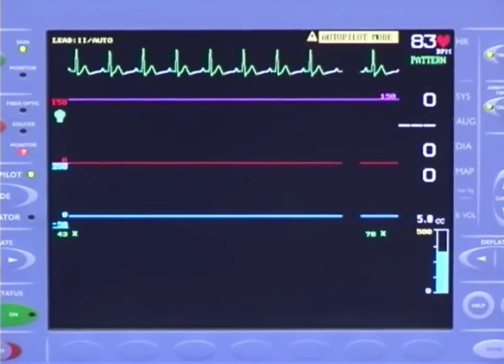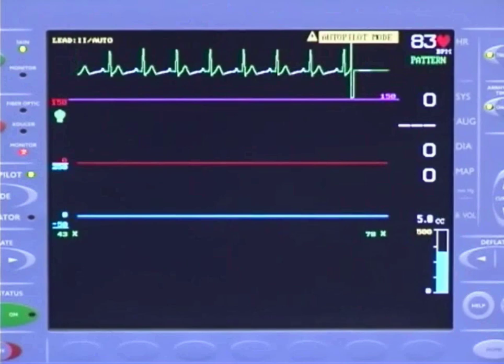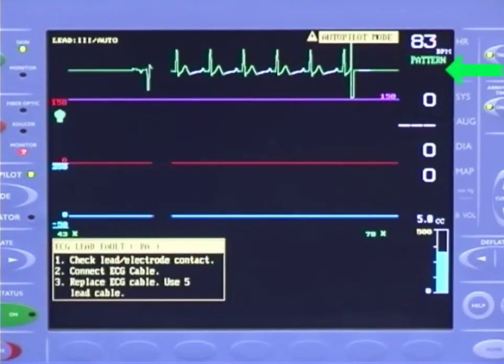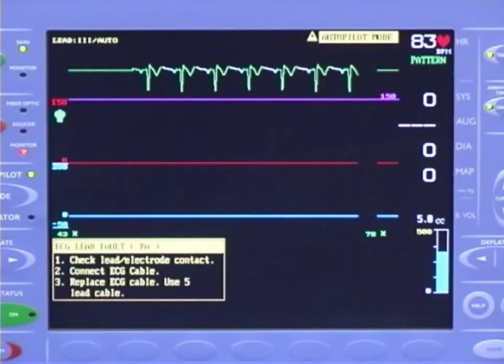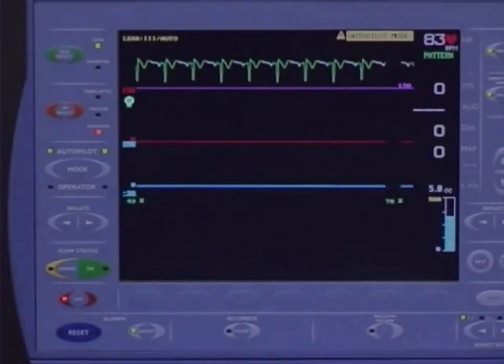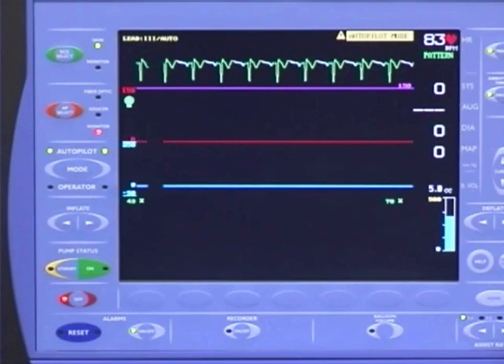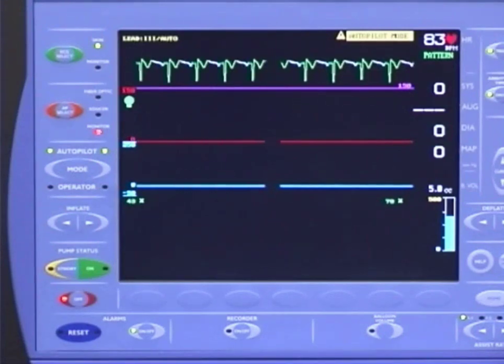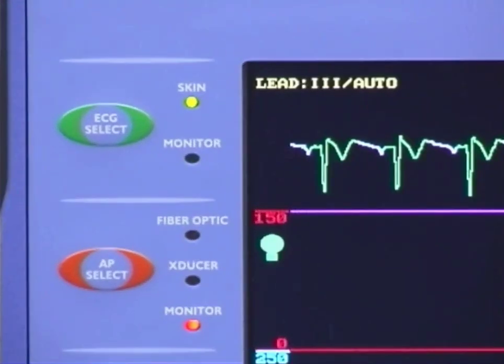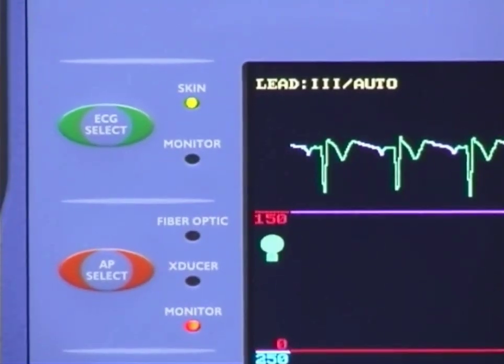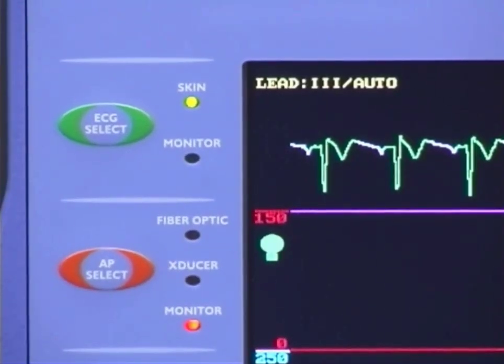AutoPilot will automatically select the ECG lead and source from those available using best signal analysis. However, even in AutoPilot, you may change the ECG lead and/or source if you so desire. Your selection will be maintained as long as it provides stable triggering. The ECG select key, located in the upper left-hand corner of the control module, is used to change leads, source and gain mode, and level of the ECG.